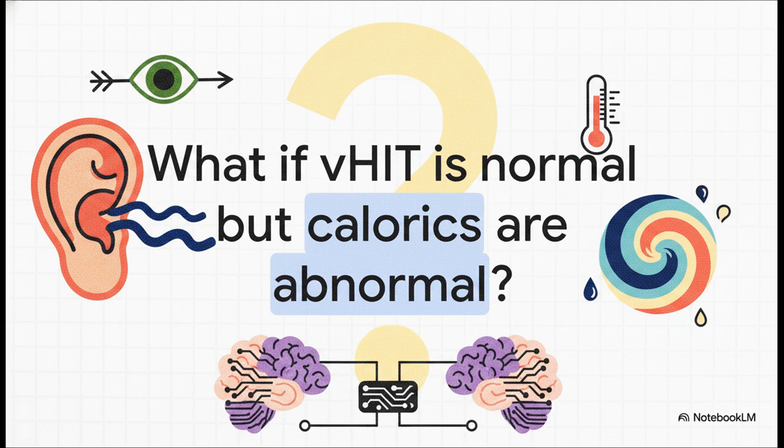But here's the really fascinating part. This combination isn't contradictory at all. In fact, it's a classic presentation of an early compensated peripheral lesion. And realizing that reading these 2 tests together completely changes your prescription, well, that's a real game changer.